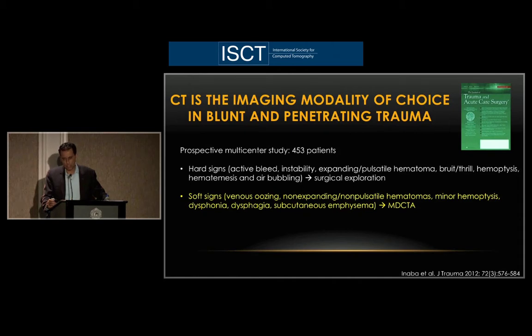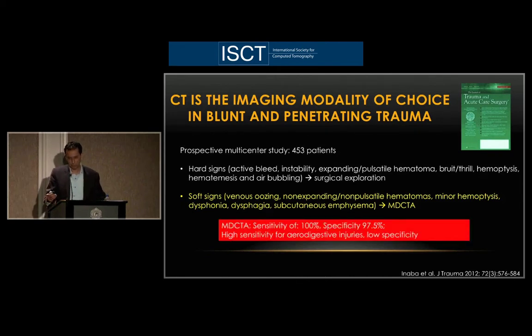Now, soft signs: venous oozing, non-expanding, non-pulsatile hematomas, minor hemoptysis, dysphonia, dysphagia, subcutaneous emphysema, those underwent MDCTA. And what they found was a sensitivity of 100% and a specificity of close to 98% for these types of injuries to the mediastinum. Very high sensitivity for aerodigestive injuries, although a lower specificity.